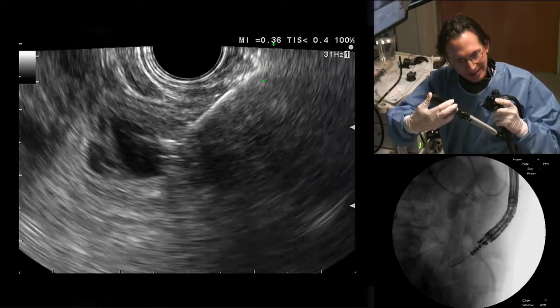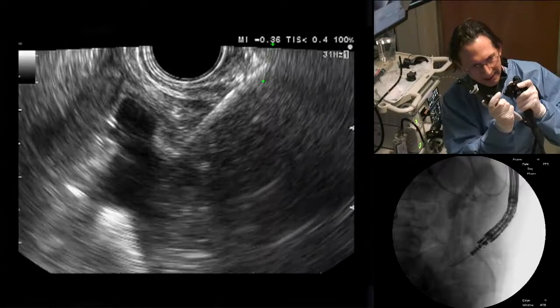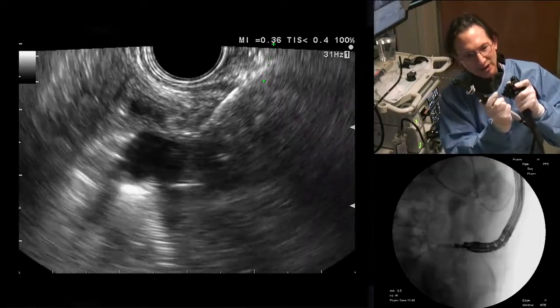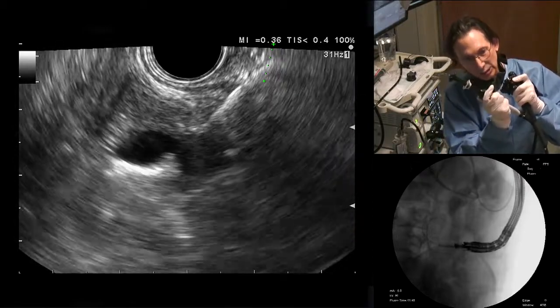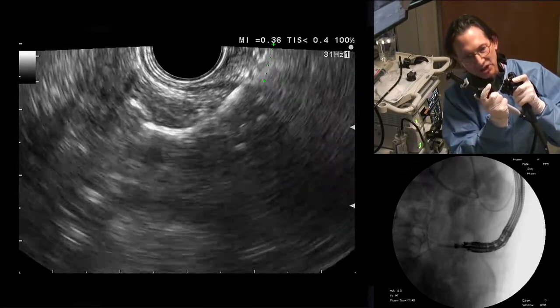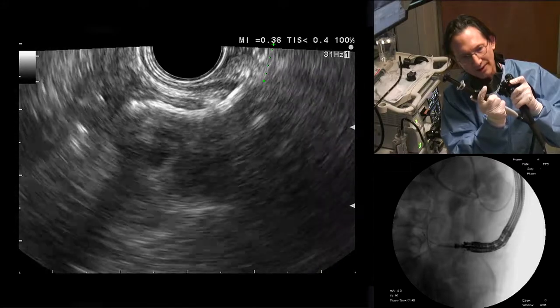That's pushing the stent out, pushing the stent out. I'm going to pull back the sheath just a little bit. We're good. Excellent. So the stent deployed a little further down. That's why I didn't see it. It was sort of at the bottom part of the image. It looks really good. See? I'm pulling it back. I'm going to snug up. This is the small bowel. I'm snugging up against the wall.